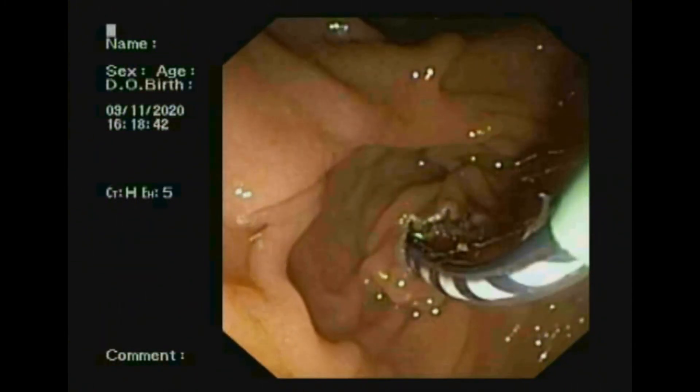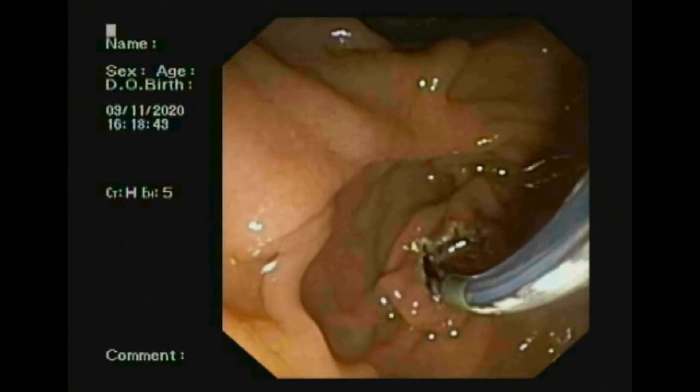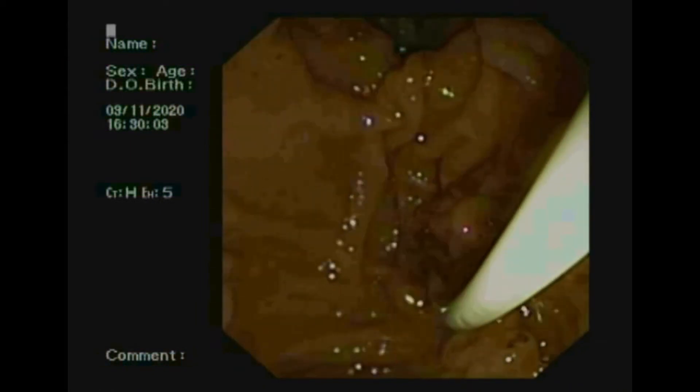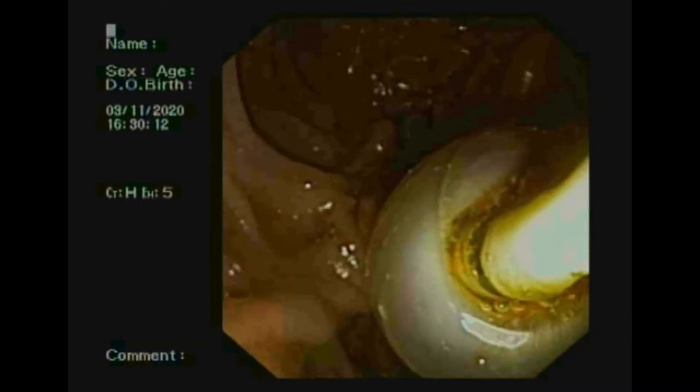I made a wide sphincterotomy, wide enough to remove the CBD stone. After sphincterotomy, a balloon was passed over the guidewire into the CBD. Now I am doing balloon sweep. You can see the black stone was removed by balloon sweep.